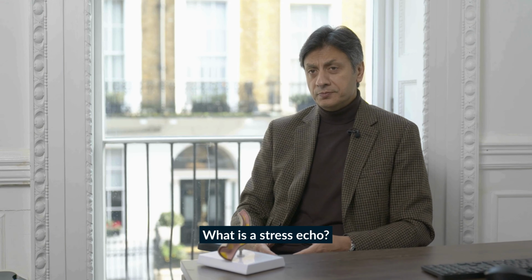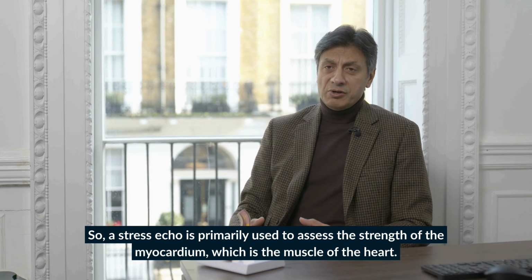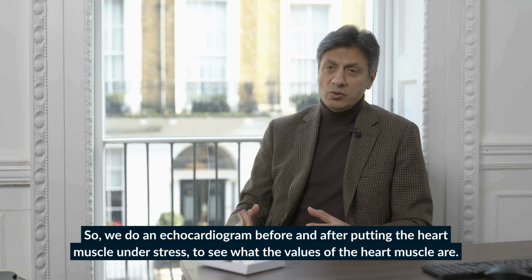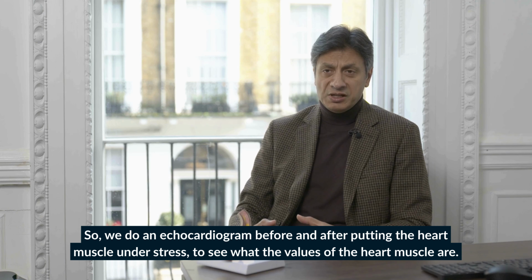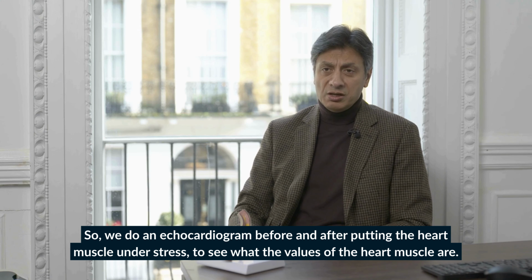What does the stress echo look for? So a stress echo is primarily used to assess the strength of the myocardium, which is the muscle of the heart. So we do an echocardiogram before and after putting the heart muscle under stress and to see what the values of the heart muscles are.